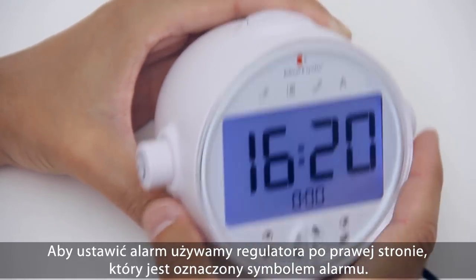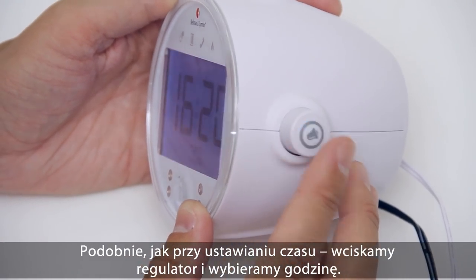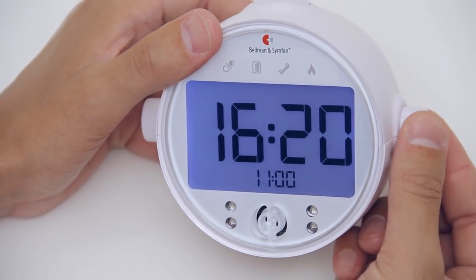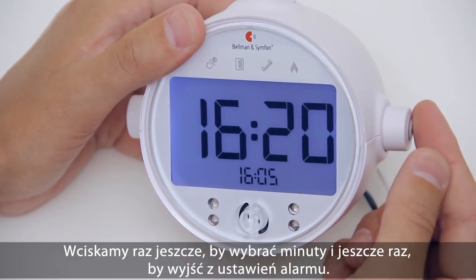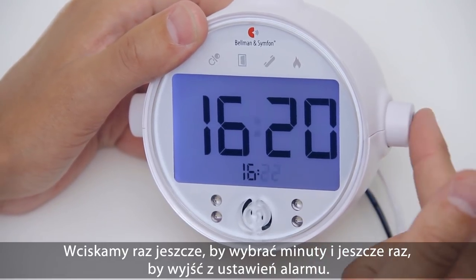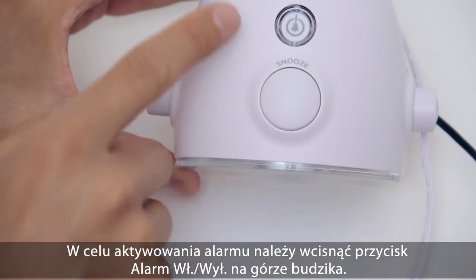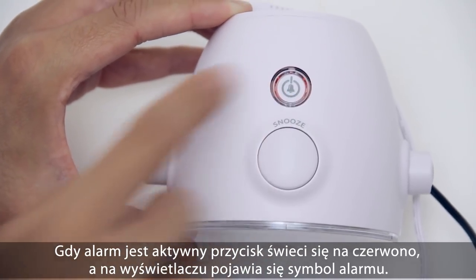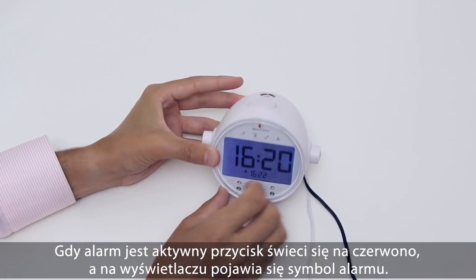To set the alarm, use the right knob, marked with an alarm symbol. Just like setting the time, press the knob and turn it to select hours. Press it again to select minutes, and one more time to exit the alarm setting. To activate the alarm, press the alarm on/off button on top of the clock. When the alarm is activated, the button lights up in red and an alarm symbol appears on the clock face.